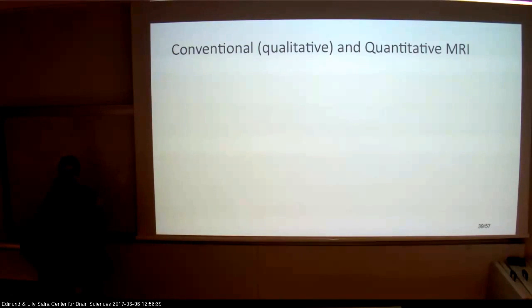לא, ב-T2 star רואים לנו את הסיגנל. זה נכון שאם אנחנו לא עושים איזושהי פעולה, נגיד ספין אקו, מחזירים אותם ב-180, אז הפרקוונסיז האחרונים שמדדנו, שאספנו, הם כבר כמעט בלי סיגנל, הם כבר עברו פול דיפייזינג, אז נורא קשה למדוד שם, אין לנו הרבה סיגנל. זה נכון מה שאתה אומר.